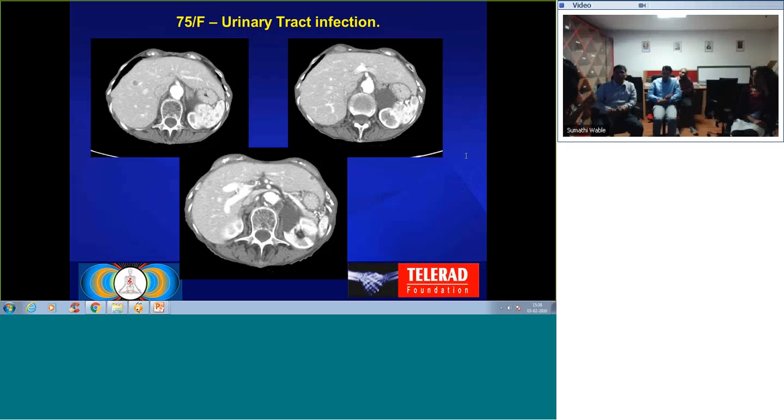Because, like you said, 1 centimeter. Do you really want to tell them to do an MRI on a 20-year-old or a 30-year-old? Common things being common, most of the time they're going to be angiomas. That's how I describe one case: a few brightly enhancing lesions, brighter than the liver parenchyma, 2-3 of them at least in any patient.